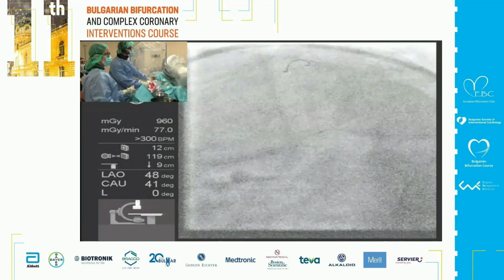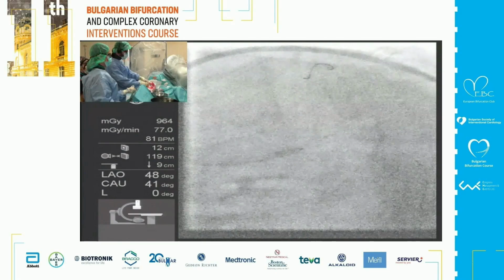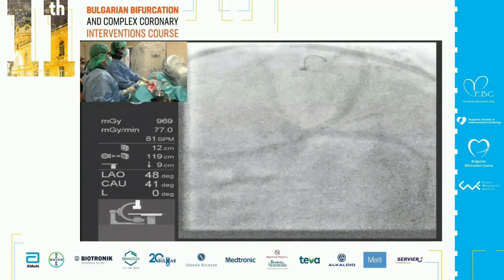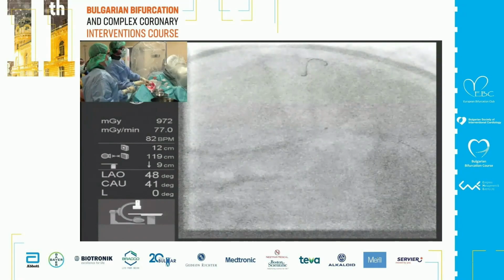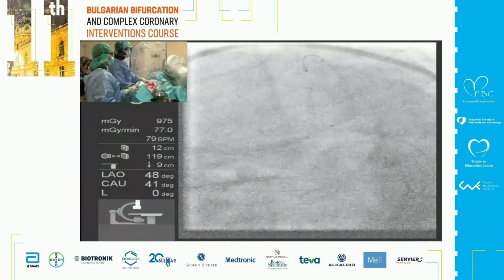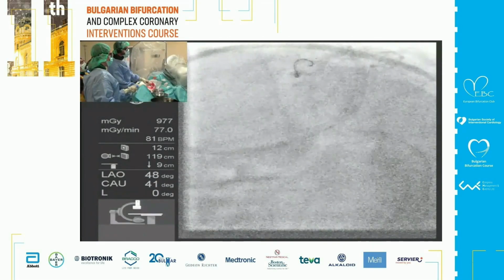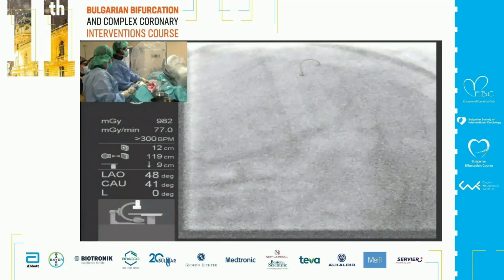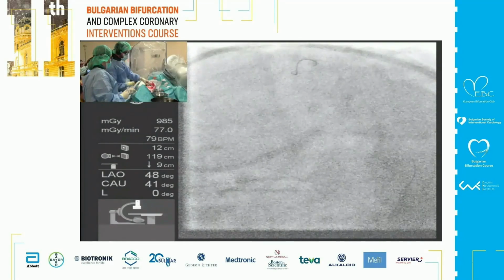There is another technique, and a small test trial. The technique called POT puff. Okay. Yeah, this is a good position. Do it again. Appropriate place. Okay. Test. Yeah, this is good. Awesome. Because distal to the marker, this is conical, so the diameter is smaller. Okay.